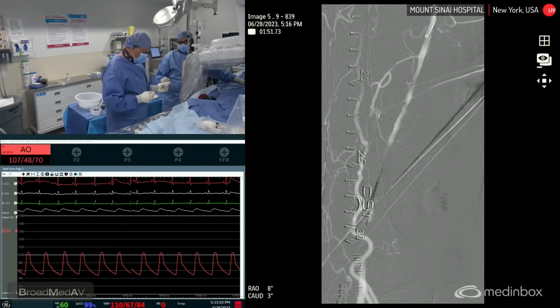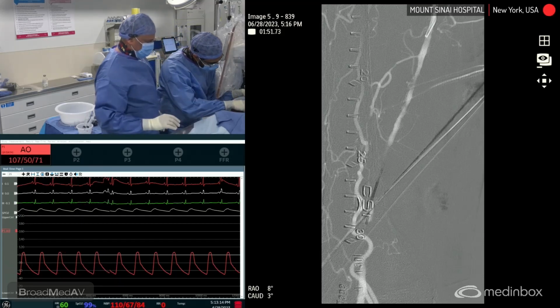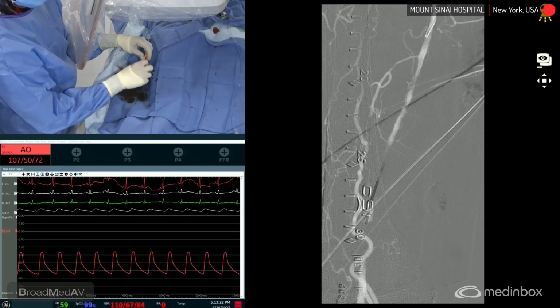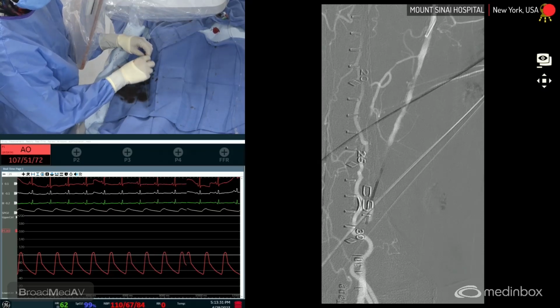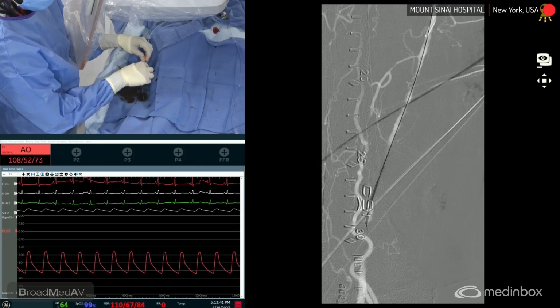So just making a friendly tip, not too violent and not too not violent. I'm going to give this to him, and then we're going to go. Once we cross, the flow in the vessel is something we're not comfortable with. The reason I pointed out the profunda filling before the SFA, and how slow the flow in the SFA was, shows that in our mind there will be some sort of layered thrombus in this, and with such poor runoff, our idea would be to aspirate the thrombus out prior to doing any sort of intervention.